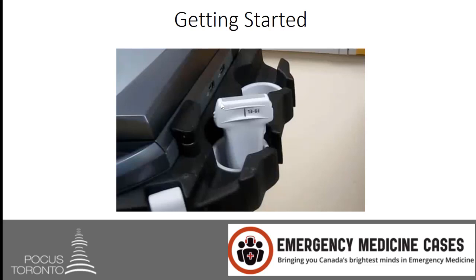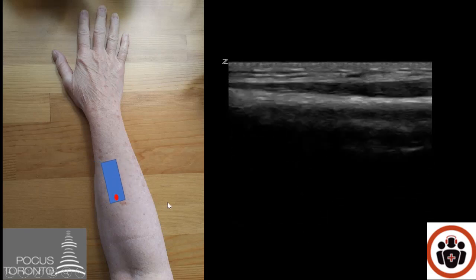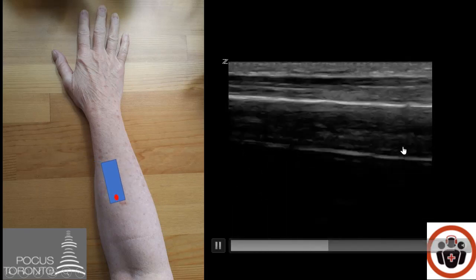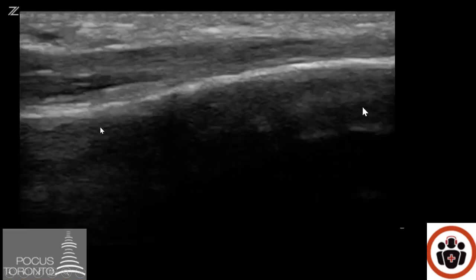To do this we're going to start with our linear probe. We're going to place the probe on the patient's arm in the longitudinal plane, where the marker is going to be parallel to the bone. The first step is to slide side to side to find exactly where the bone is. The image you want to generate is the bone as a bright white line across the screen in the longitudinal plane.